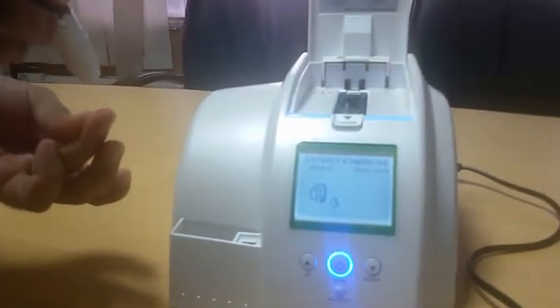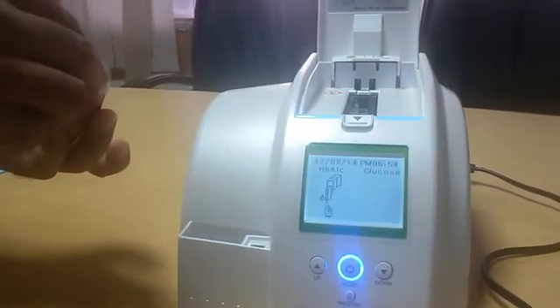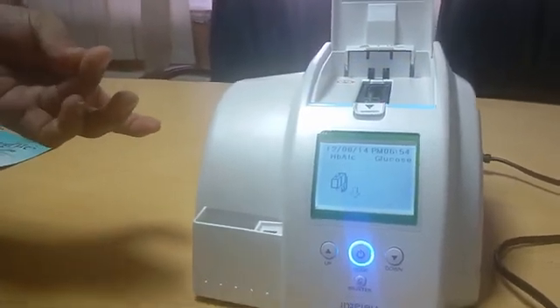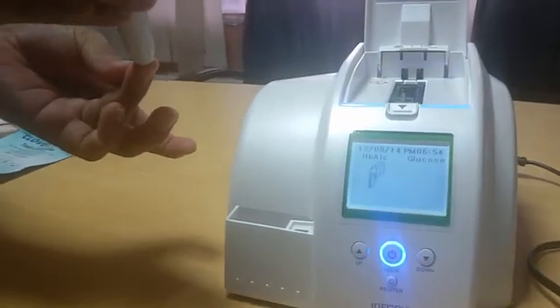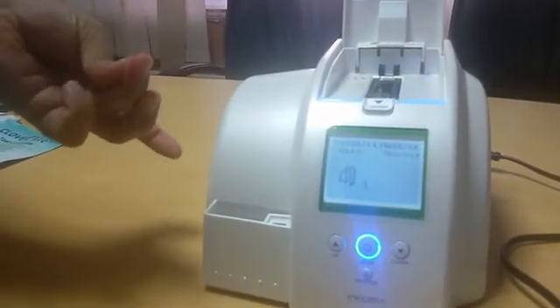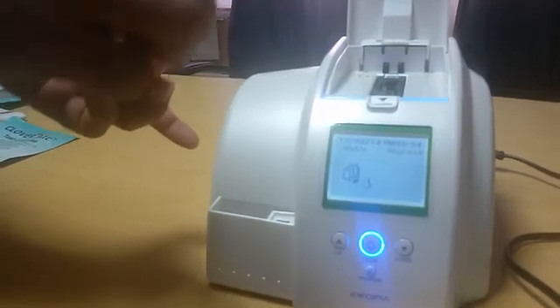Now clean the ring finger with wet cotton and prick on the side of the finger. Wipe off the first drop of blood.